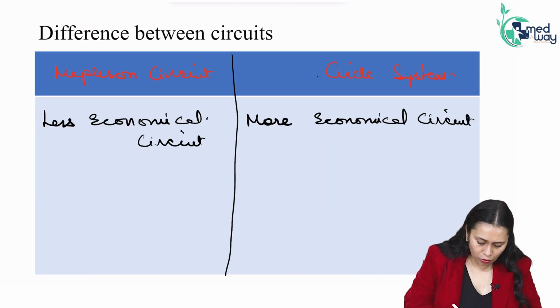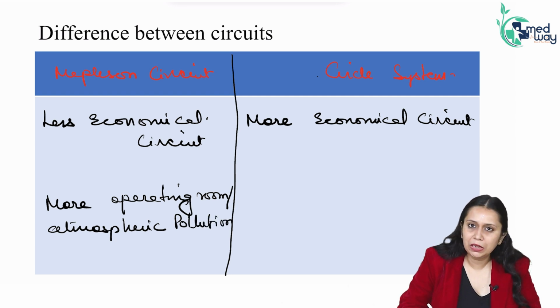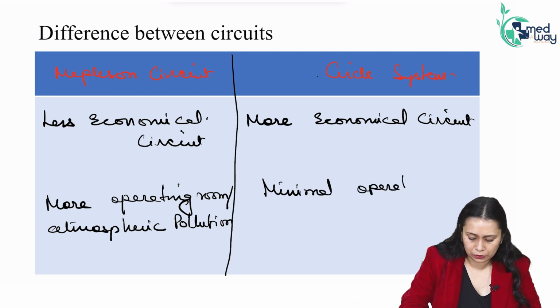So more operating room pollution, atmospheric pollution, right? Here, minimal pollution. This is minimal operating room pollution.